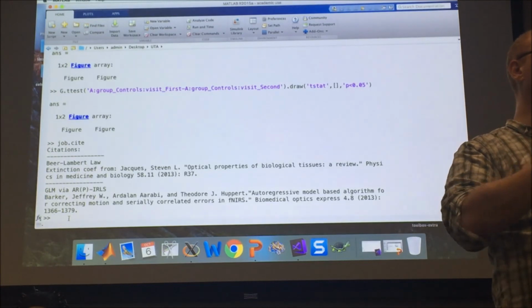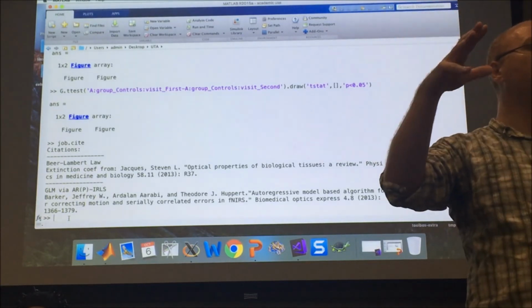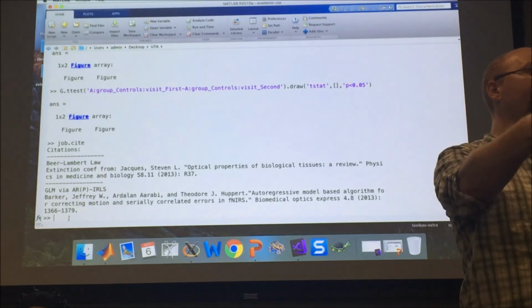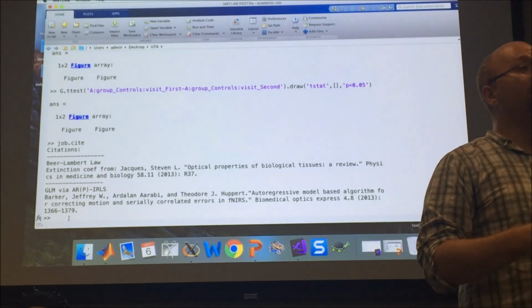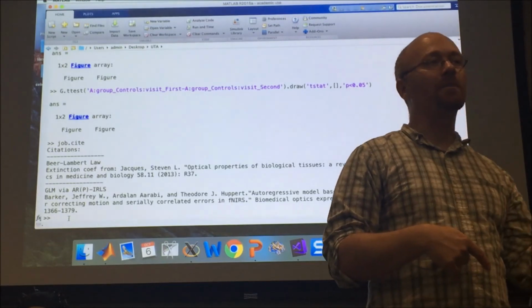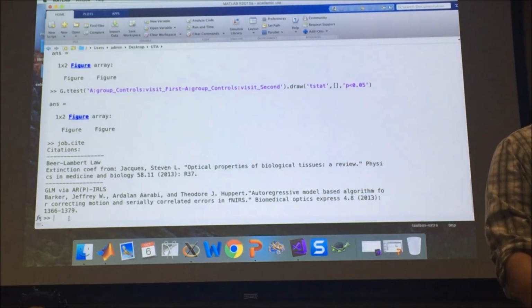And because we have all that spatial covariance, the channel by condition covariance from the first level models, when we run the ANOVA, we're actually doing a weighted version that takes that into account. And I can write down all the equations. The talk I gave right before lunch, where I said there's a bunch of slides that I'm skipping, has all those equations in it. So I'll share that. That's fine, but it's not really published anywhere yet.